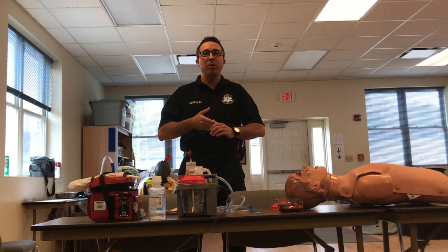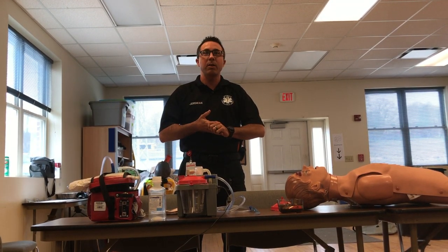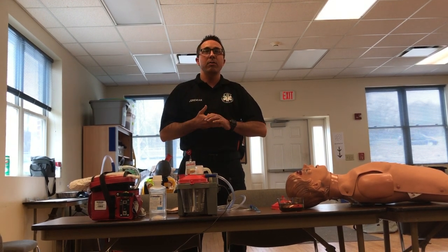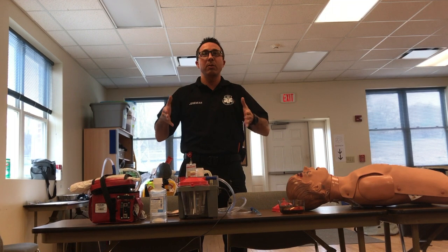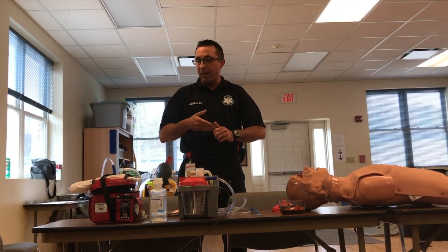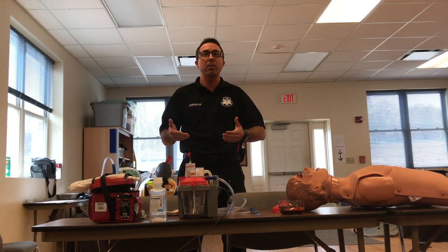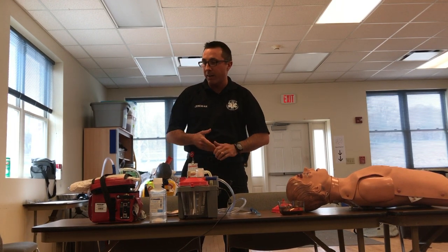Hey guys, Jeremiah here to do a quick tutorial on how to use a portable suction unit. For those of you who are going through EMT class, make sure that you become familiar with your equipment. If you have portable suction units, you want to make sure that you use them in class, that you assemble them, and you're familiar with how they work and operate.